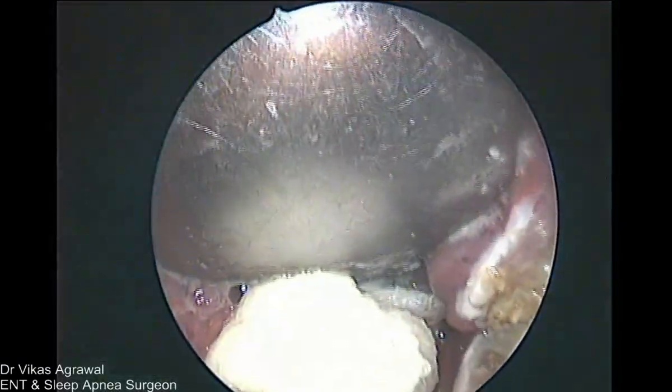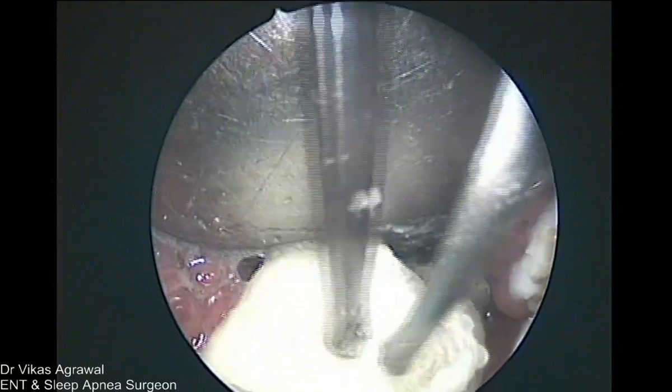Mouth opening of the patient is not very bad, but the tongue is big, na? Okay. So now you are showing the endoscopic picture.